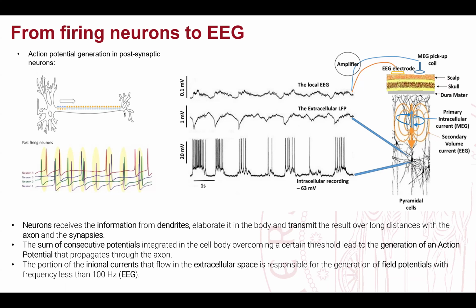I always use this because I think it is a powerful example: when we work with the EEG signal, what we are really measuring is the noise produced by our brain when we think. It is not really what our brain is doing, but when it is doing its thing, it produces some noise, and what we can record is exactly this noise. We need to work with what we have.